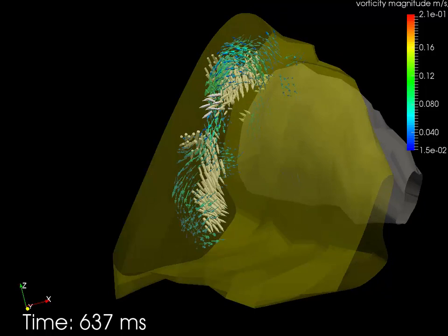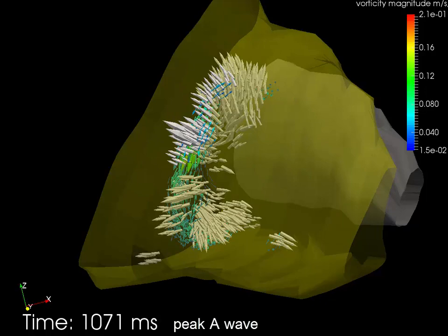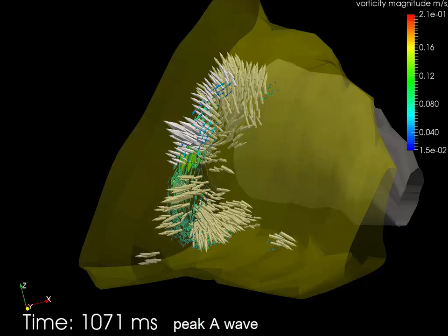Moving forward in time again to the last portion of diastole, the A wave. Here we can see flow around the leaflets, around all the leaflets, and very little flow in the actual core of the tricuspid jet.